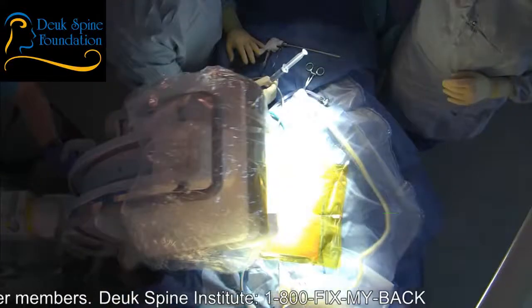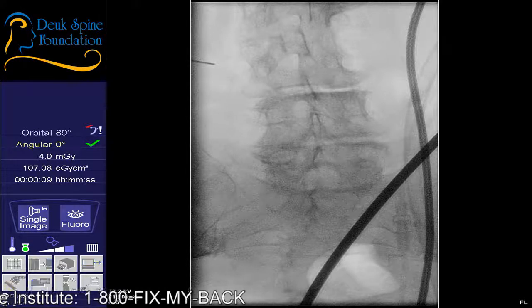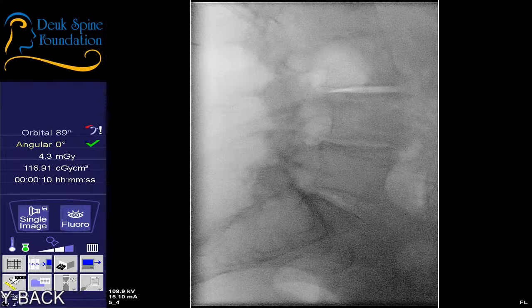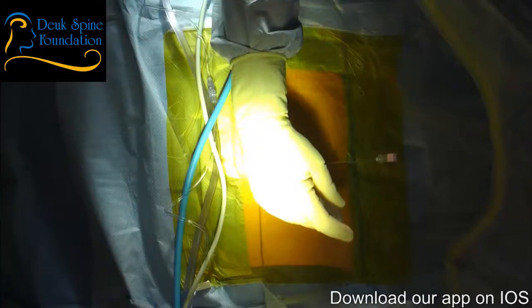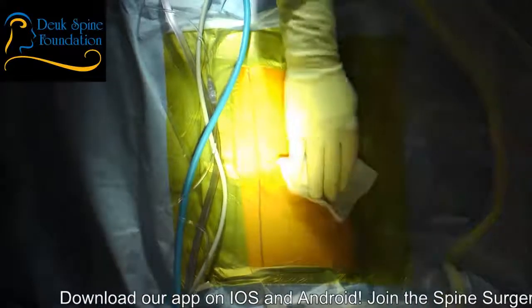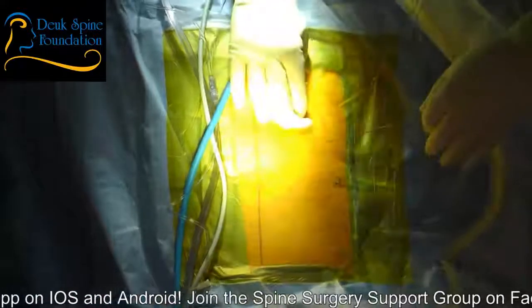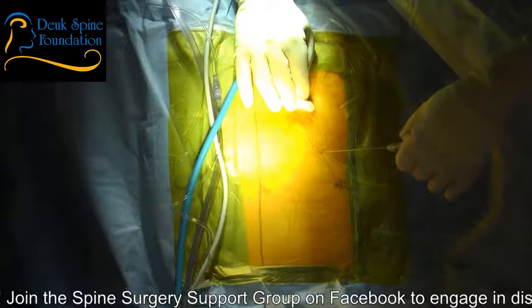The lateral view is the best view to identify what disc we are at, and it's the best view to navigate to the foramen. The AP view is also necessary, so we're high. We need to get a little bit lower. No problem. Let's have that local again for the skin, the numbing medicine. Do you feel this going in? You feel anything there? No? Yes? All right. Are you comfortable? Without the x-ray picture, it's impossible for me to know where we are in the spine. So I use the x-ray image to guide my treatment. Without it, the surgery would be impossible.